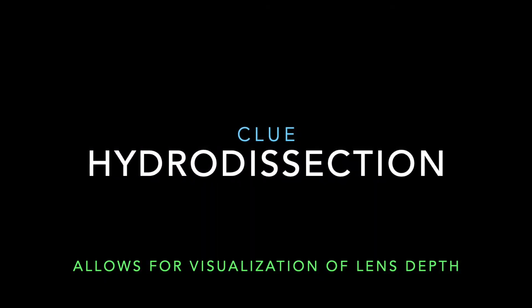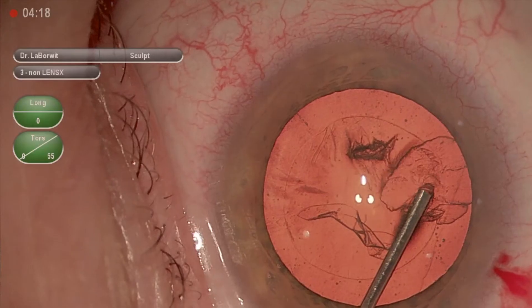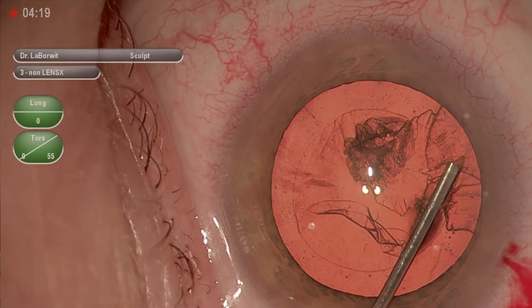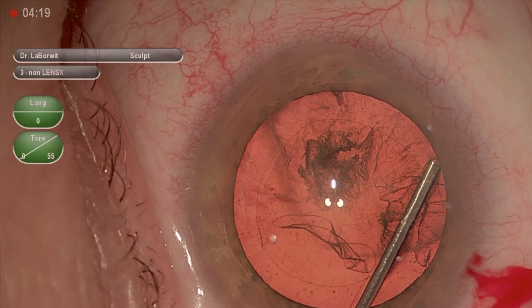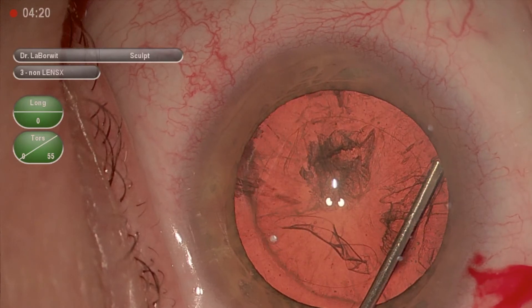I'm always looking for clues as to the depth of the lens, and during hydrodissection with a good red reflex, you can see that as the fluid wave comes posterior, a lot of times you can get a sense of how deep you'll need to groove.